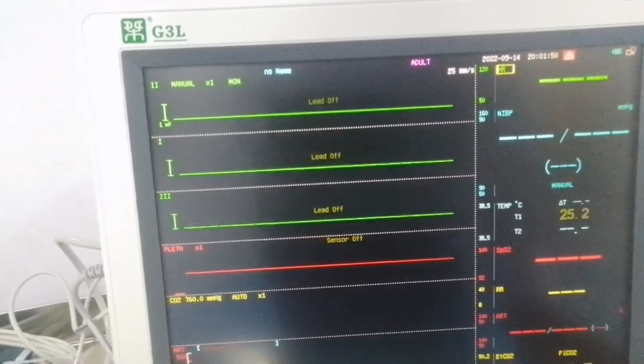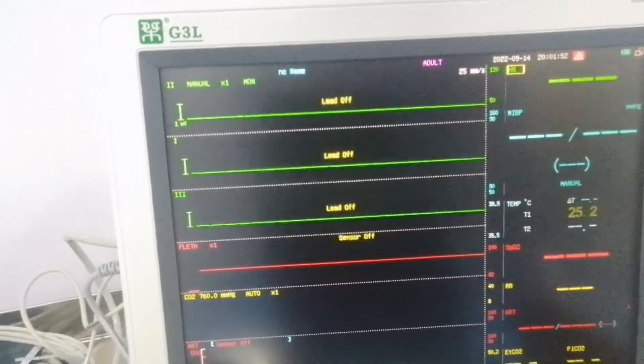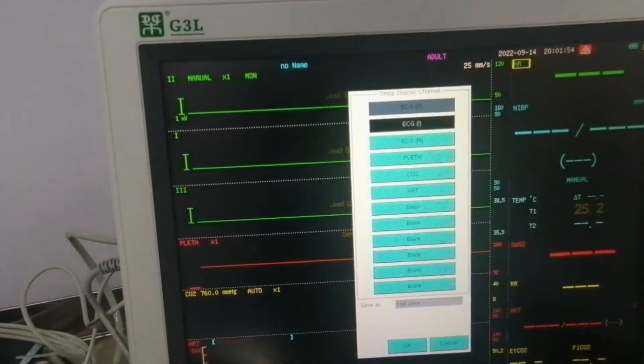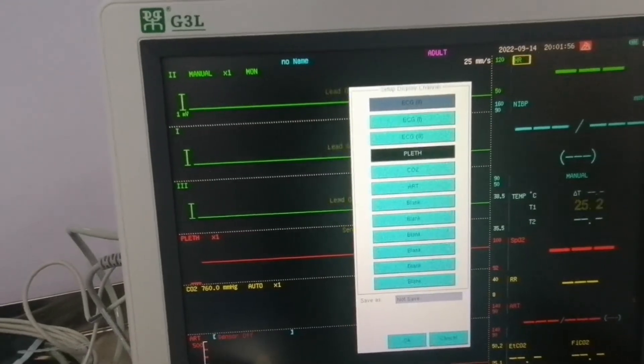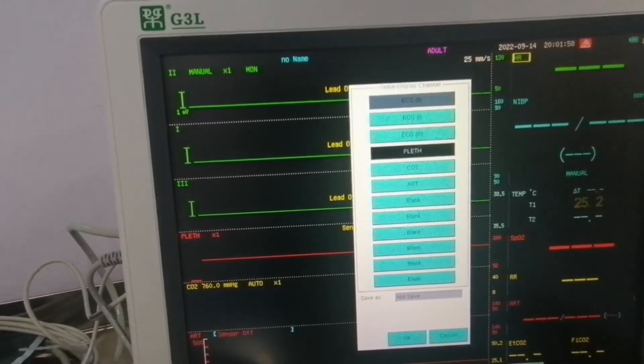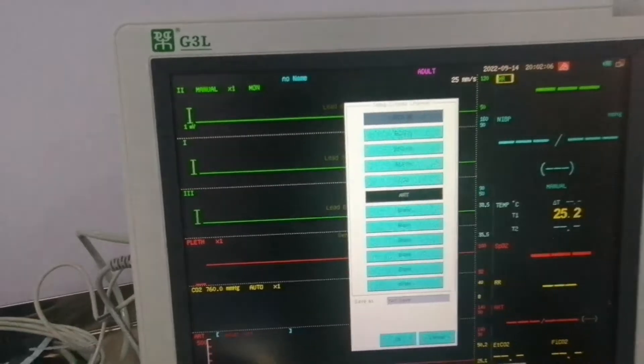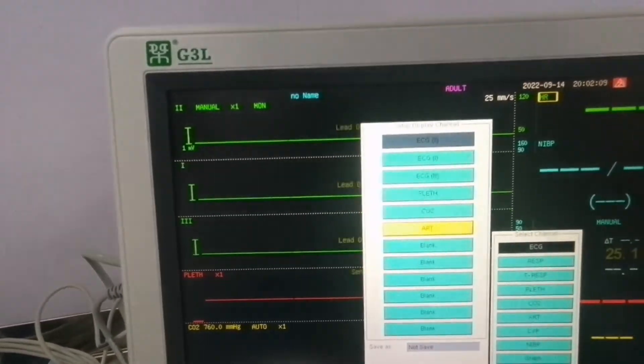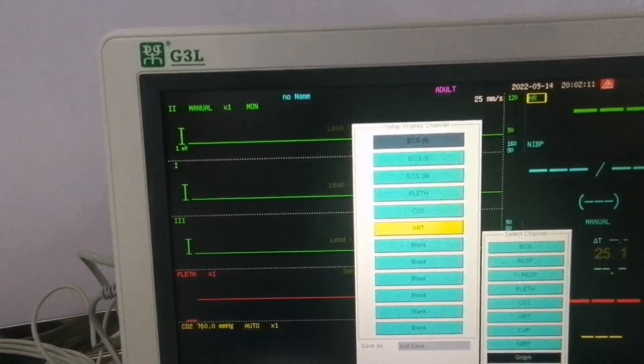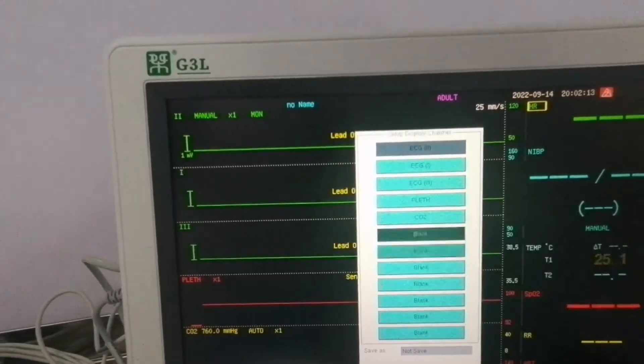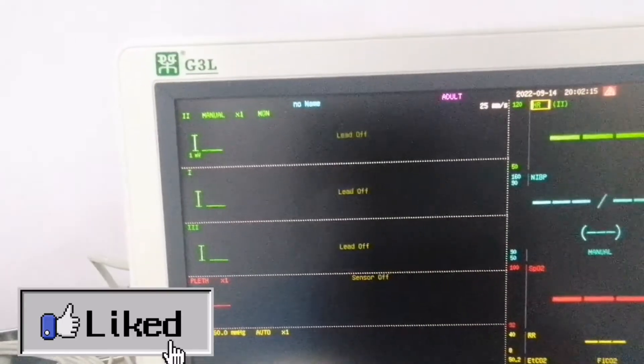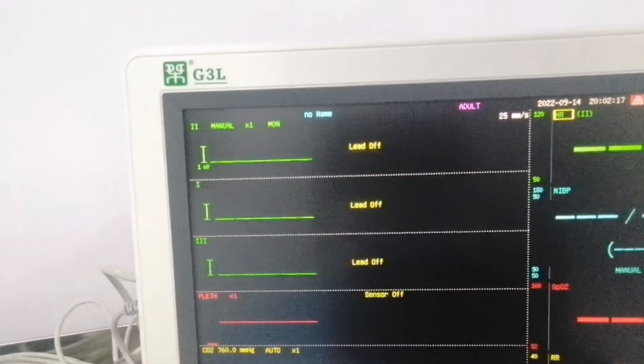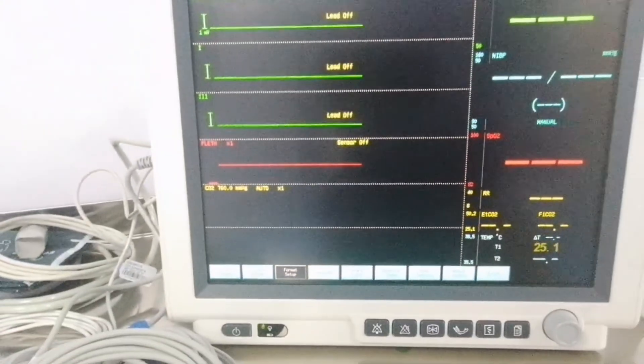So if we want to remove any module waveform from the screen, you will go to format setup and change the parameter accordingly. Like I want to remove the arterial blood pressure. So I press the arterial blood pressure and select blank. So the arterial blood pressure will be removed from the main display. So this is the display parameter settings.